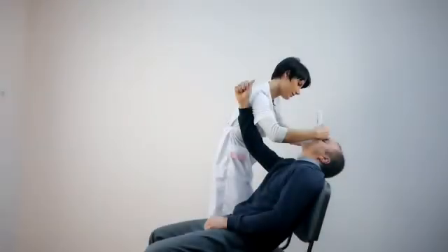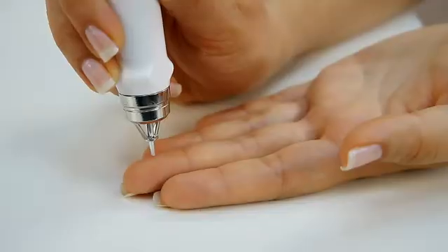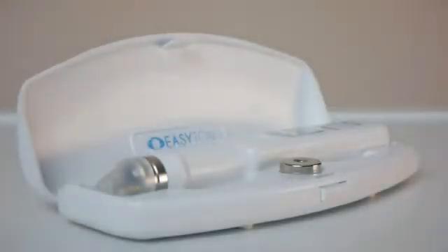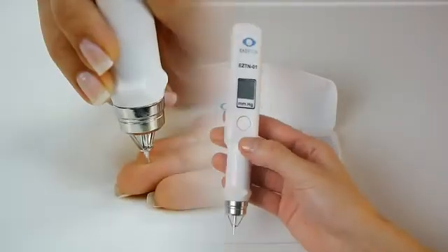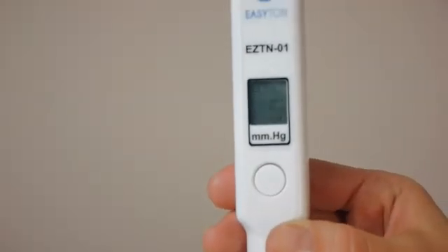How to train your measuring skills. To master the skill of IOP measurement, one needs 10 to 20 minutes of training on the tester or on finger pads. Using the tester for measurement. Use the tester to train and master your measuring skills. Using finger pads for measurement. You can also train basic measuring skills by using your own finger pads as testing samples. When training your measuring skills, both on the tester and the finger pads, try to get the same results on the same measuring spot.